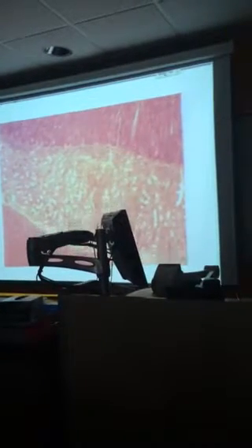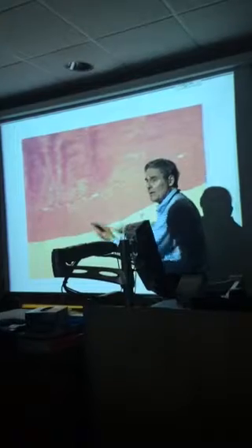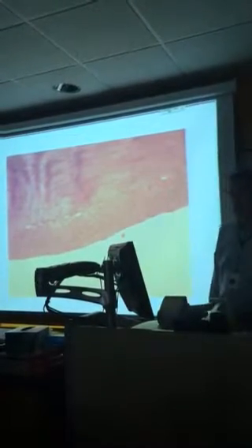Then we get to the muscle layers again, just like we saw before. We have two muscle layers. The inner layer, next to the submucosa, runs around the circumference of the organ. This is circular smooth muscle. The outer layer runs parallel to the longitudinal axis, coming down the plane of the screen here. That is longitudinal smooth muscle. So two muscle layers: inner one, adjacent to the submucosa, circular smooth muscle; the outer one, longitudinal smooth muscle. Remember that. When we get to the next organ system, it's going to be reversed. But for now, the gospel is inner circular, outer longitudinal smooth muscle.